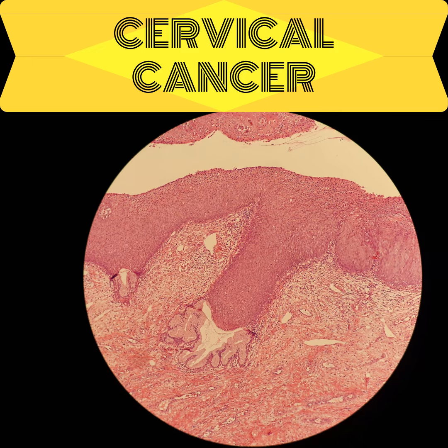of angiolymphatic invasion. In many cases, the transition between the dysplastic squamous cells and the remaining mucin-producing columnar cells of the gland is abrupt. This specific finding of gland involvement increases the surface area of the lesion and is a known risk factor for recurrence after local excision procedures like the loop electrosurgical excision procedure or cold knife conization.